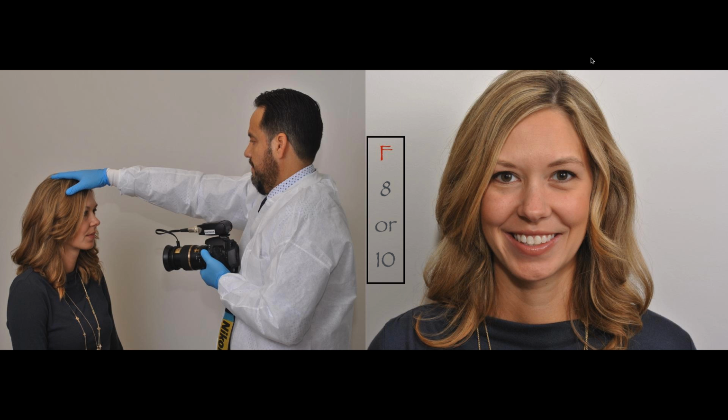So the first thing that I do is just like you see here, I have my white lab coat. I have my gloves on. I haven't placed my hands in the patient's mouth. These are brand new gloves. I'm going to hold her head for this photo. This is how I start. I start with the external photos, with the full face photos, and then I work myself in.